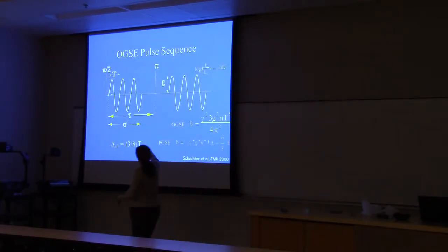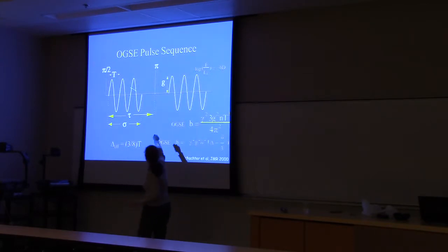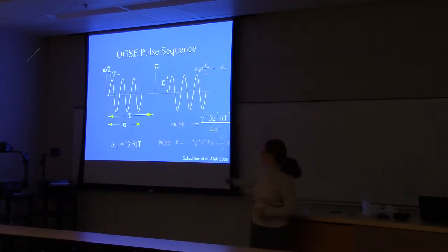So basically what we have here is this positive going gradient pulse, and then this negative going gradient pulse. So we dephase the spins and we rephase them. So if there's no diffusion, they'd all be in phase again. Then we dephase and rephase, and dephase and rephase. So right there, we kind of got the experiment to average 3 times. And over here, we average 3 more. I just put 3 up here because it's easy to draw.